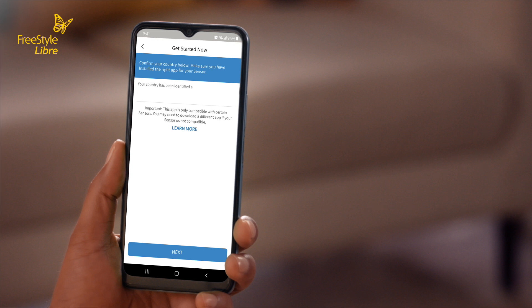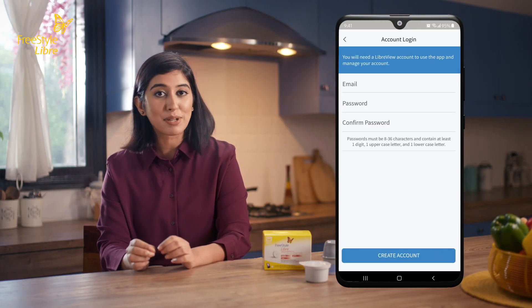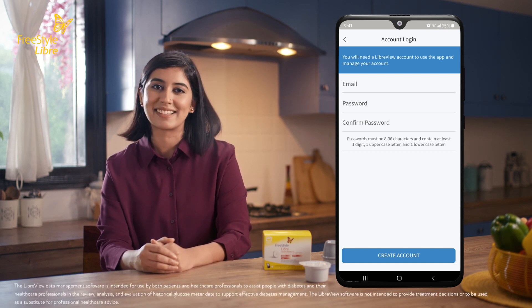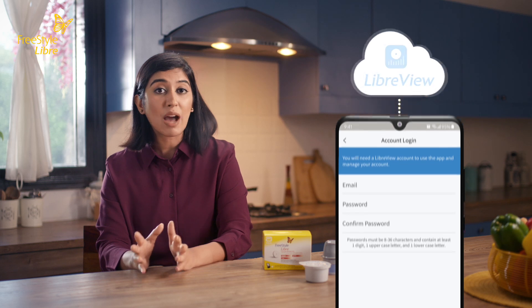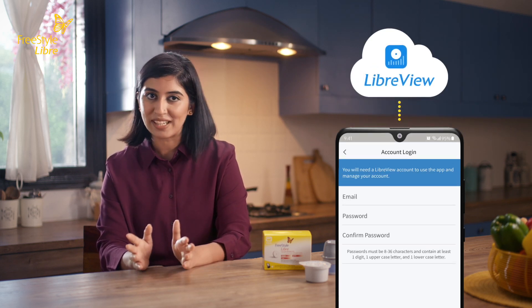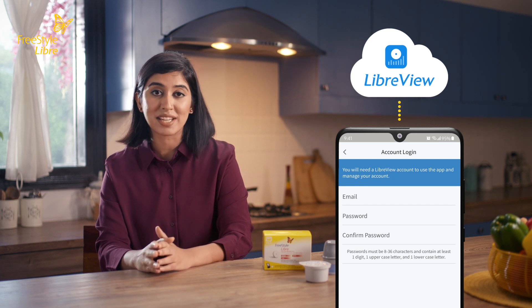It's important to set your country to your place of residence. Enter your information. When you set up your account in the Freestyle Libre link app, a LibreView account will automatically be created. LibreView is a cloud-based platform that ensures your data is stored securely and allows you to share glucose data with your doctor.